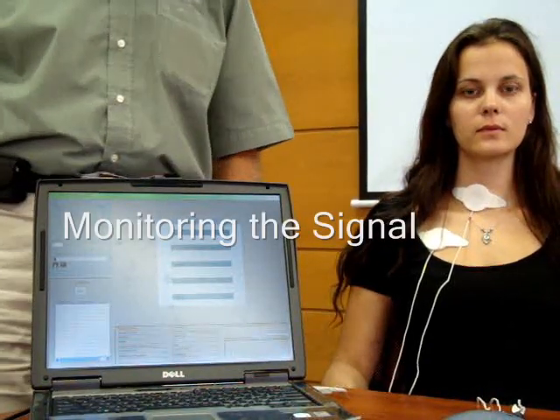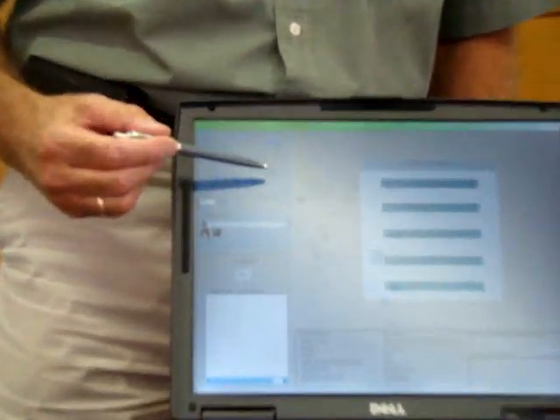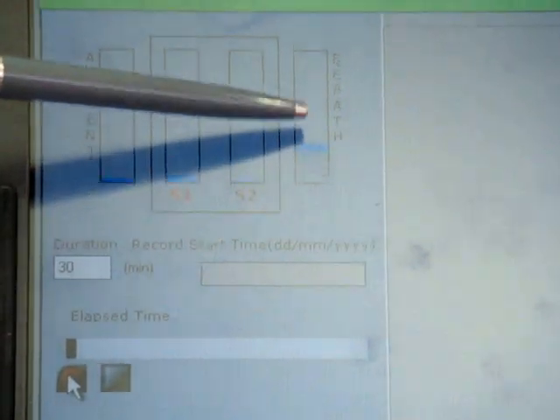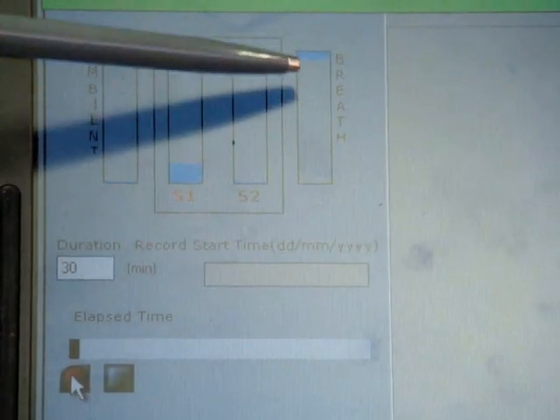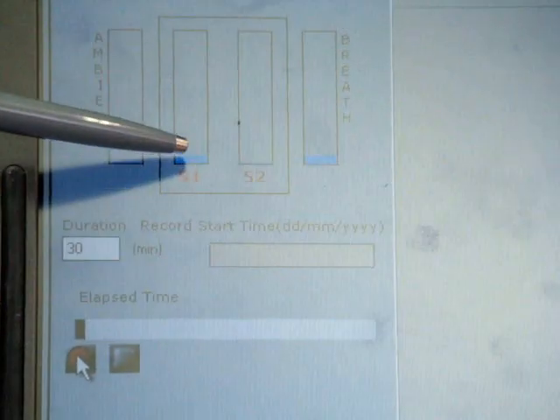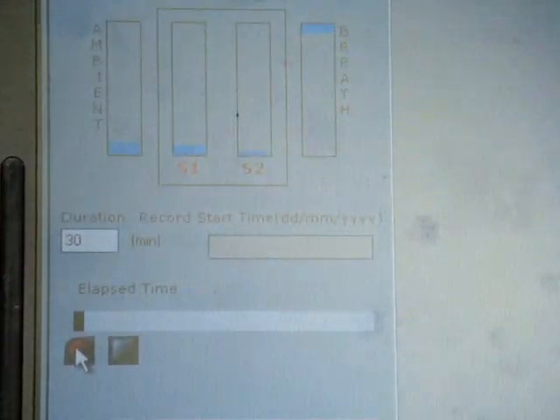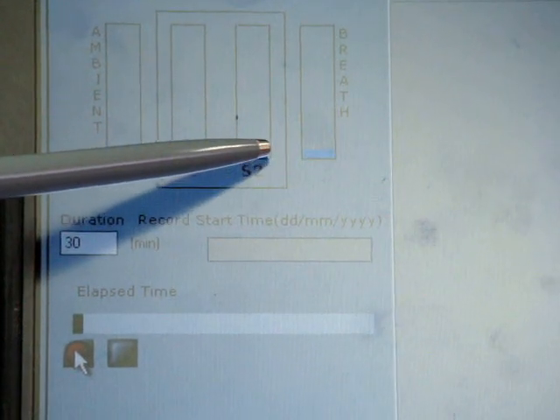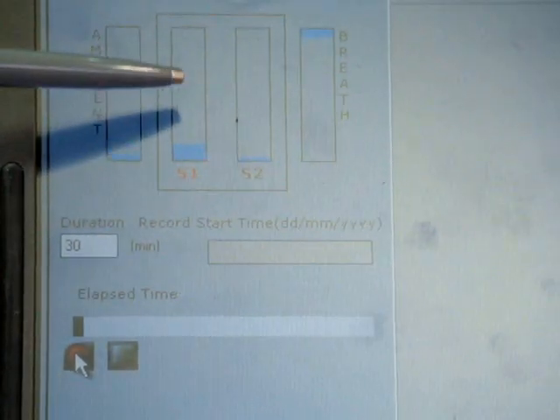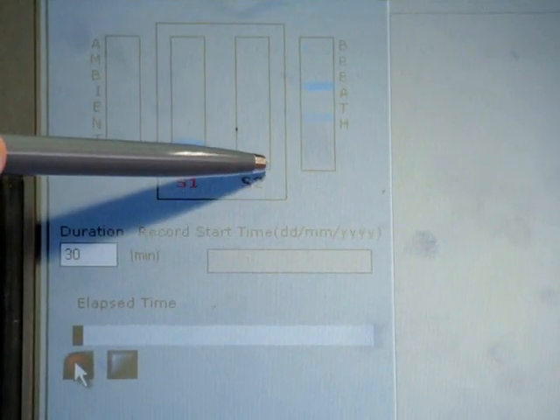Once the sensors are in position, we check the computer screen to see if we have adequate recording. The bar here shows the signal from the pneumogram with inspiration up and expiration down, and as she breathes you can see it going up and down. These two bars are from the sensors: this is the volume of sound from the tracheal sensor and the volume of sound from the chest sensor. As is quite normal, the volume of sound from the tracheal sensor is much more than from the chest sensor.